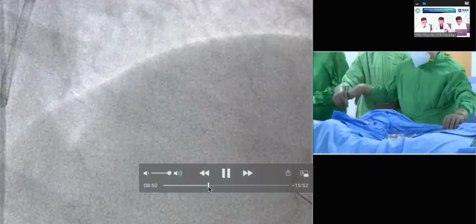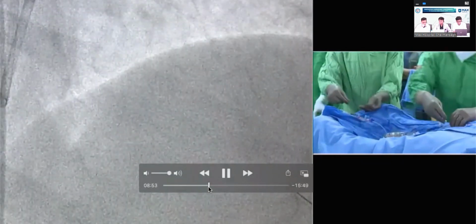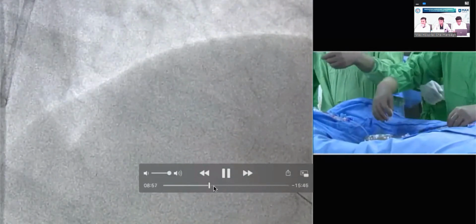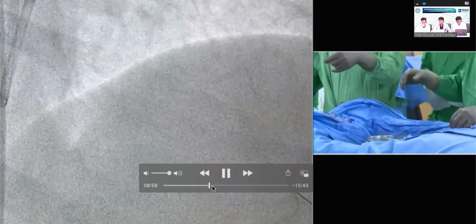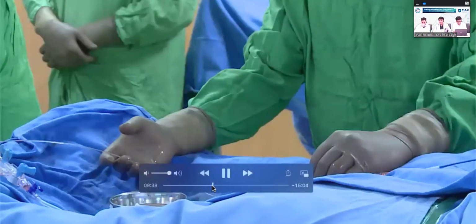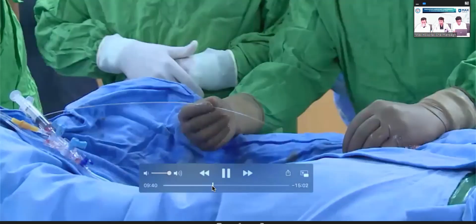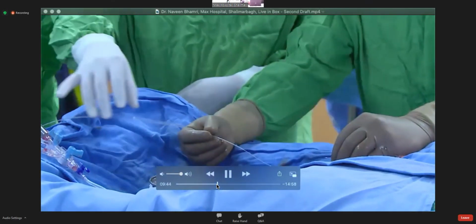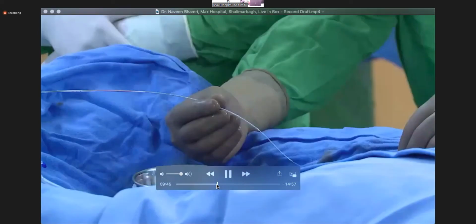Now we are going to do ablation for no more than 10 to 15 seconds; we have to stop in between. And we are using the ready-made flush solution. So we are checking the rota before going inside.